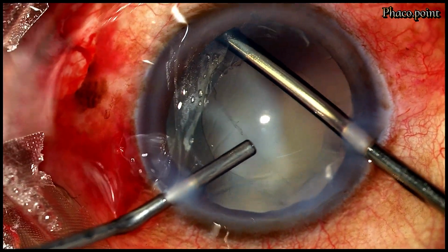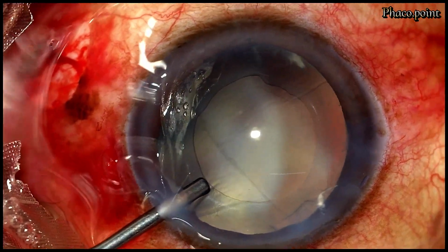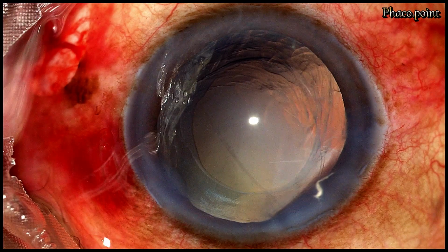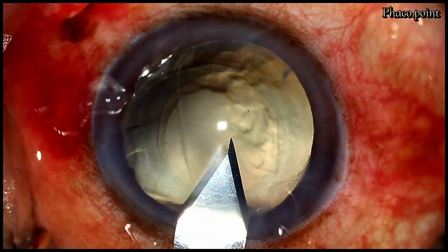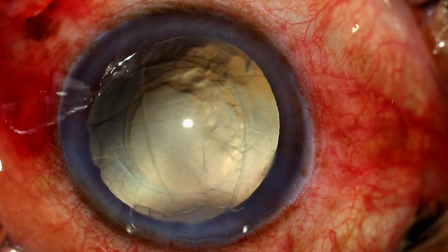We've now understood that when faced with a nucleus drop, step 1 is to introduce some triamcinolone to look for any disturbed vitreous. Should you find it, you need to perform a limited anterior vitrectomy wherein the entire disturbed vitreous needs to be cut, after which in the IA cut mode, the cortex needs to be carefully removed without compromising the anterior capsule. Finally, having achieved this, we now move to implanting the 3-piece IOL in the ciliary sulcus, for which you can see we've now taken a 3.2mm keratome and enlarged the main incision to about 3.4 to 3.6 millimeters. Let's now understand the loading and the implantation of the 3-piece IOL.